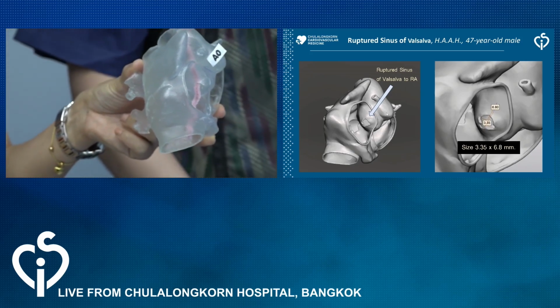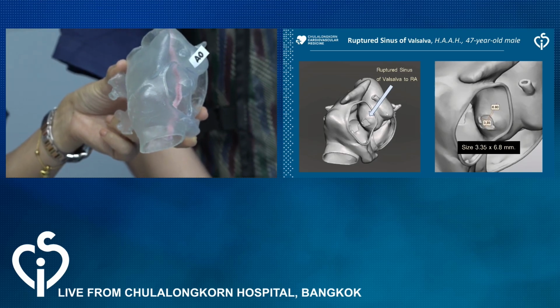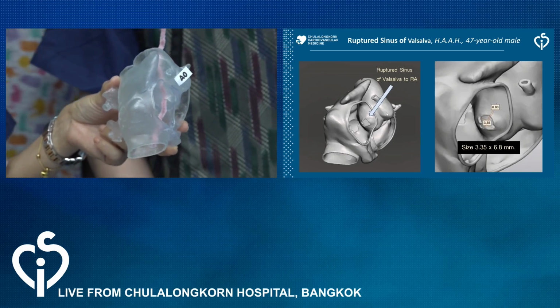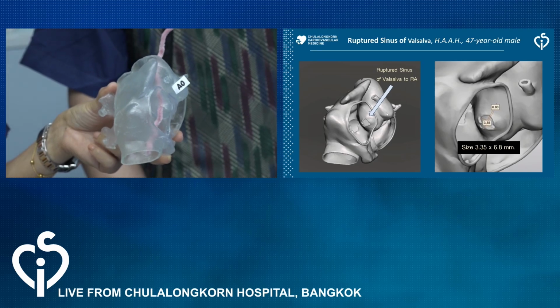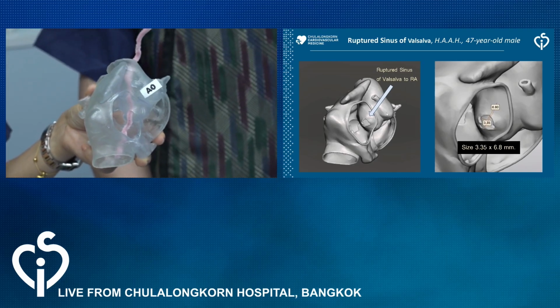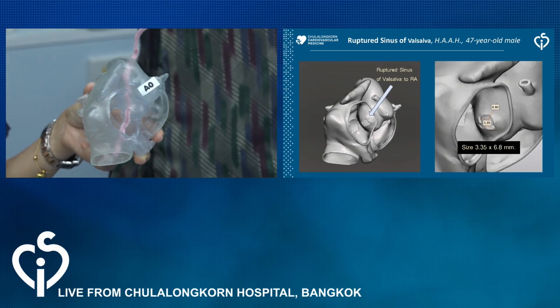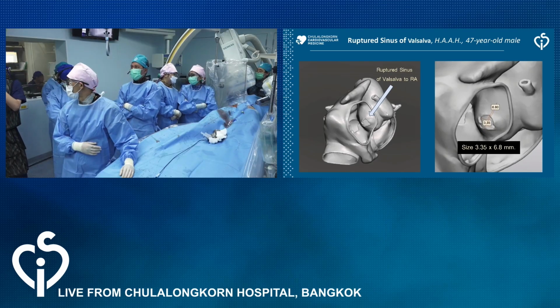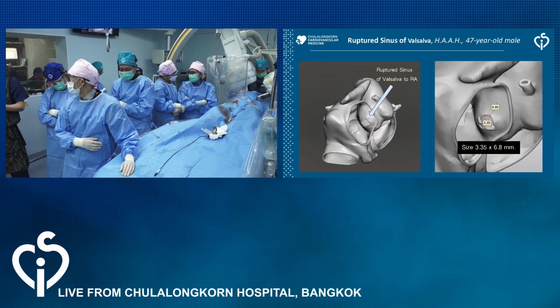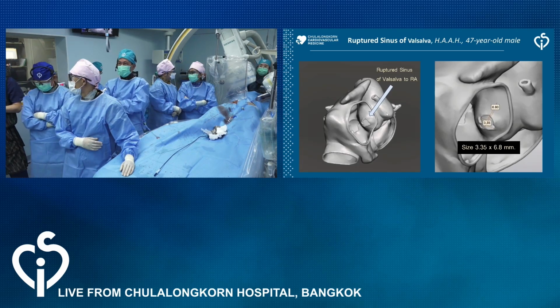Before we put something in the model, what do you think about the case? Would you close it if we need to, and which device do you recommend? Let me just pick on Haysam: to close or not to close, and if so, with what?